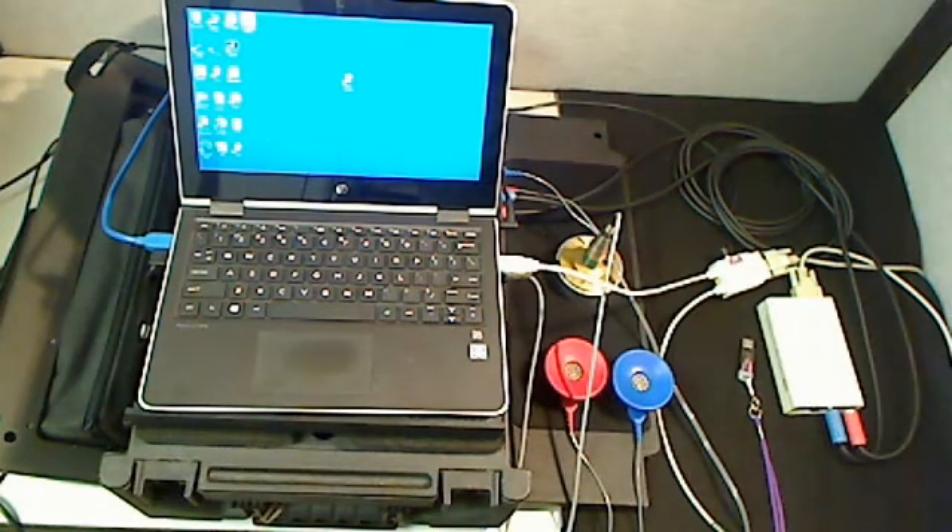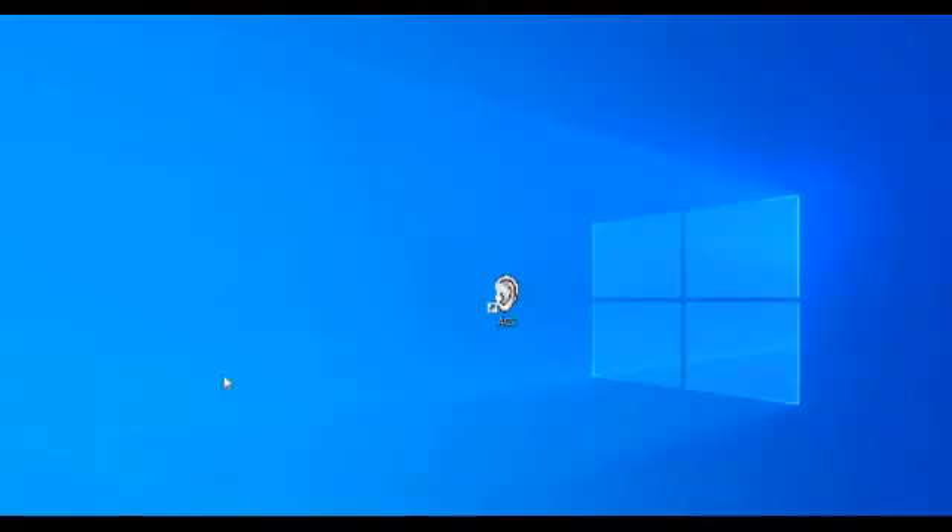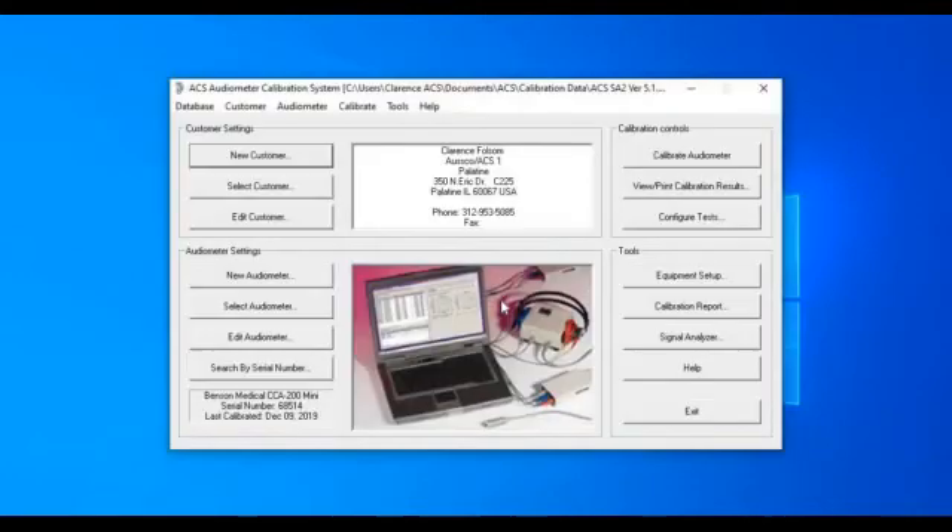The ACS unit can take complete control of the audiometer. Now we're ready to go. All I have to do is click on this little icon of the ear — this is ACS — and there is the opening screen to the ACS calibration system. You can enter a new customer, select a customer, or a new audiometer. But we've been working with this unit, the Benson CCA200. We know that's the one because right there is the serial number. So the only thing I have to do now is come up and calibrate.